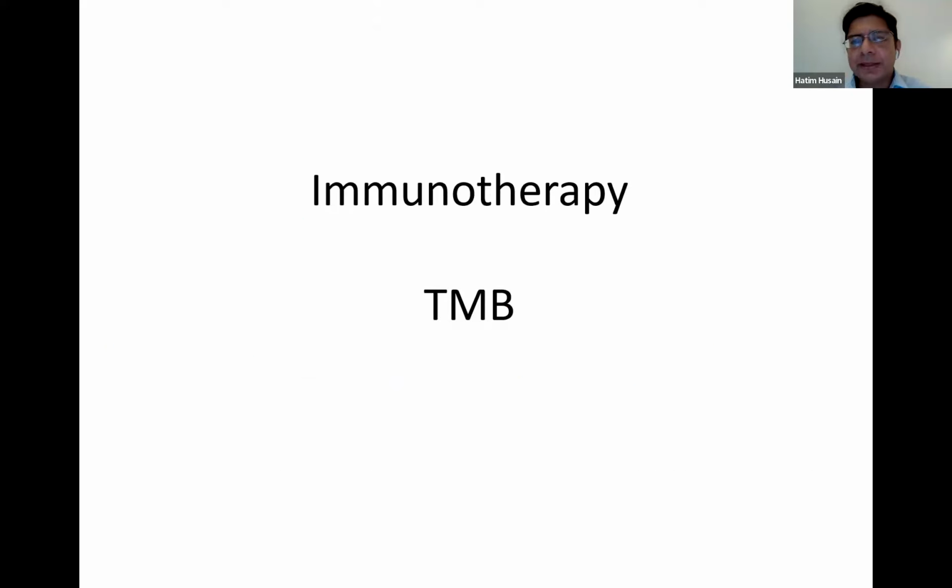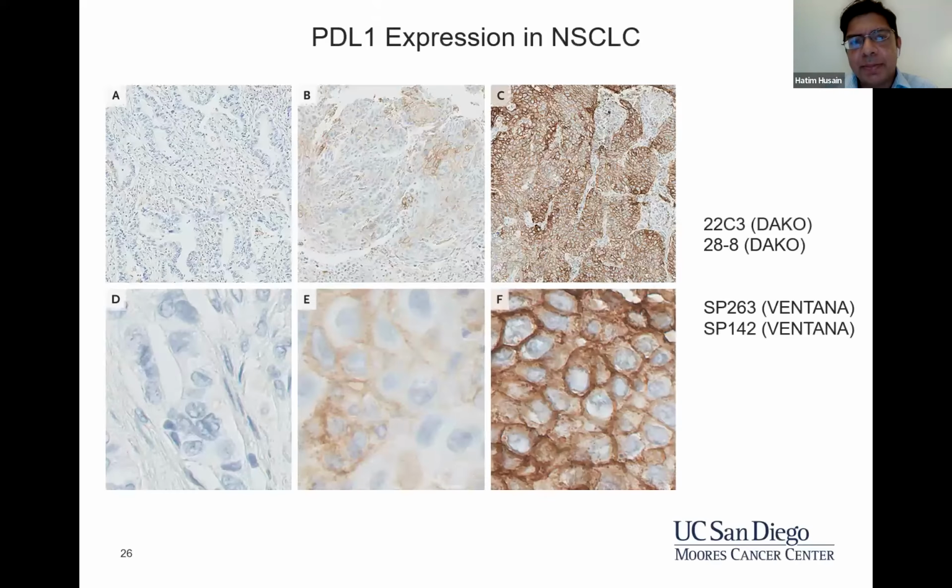So maybe in our last few minutes, we're going to tackle this concept of biomarkers and immune therapy. PD-L1 is an incomplete biomarker. This is PD-L1 negative. This is positive. We can see, highly positive, but there is this gray zone of how we actually truly define different levels. It is being called by pathologists, and having a more quantitative assessment that can be used in addition may be helpful.